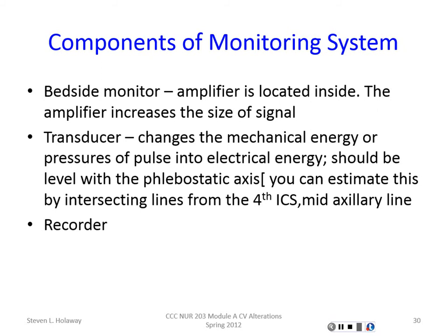I'm going to say, flush the proximal port, which is the blue port. I'm going to watch for what's coming in. Flush the infusion port. I'm going to watch for it coming out. That way I have this now primed, and I'm ready to insert it. As I put this in, I'm watching all this hooked up to the transducers, and I can watch these waveforms. So I'm now pushing this in through the port I'm inserting. Once I get to the waveform of the right atrium, I say blow up the balloon.